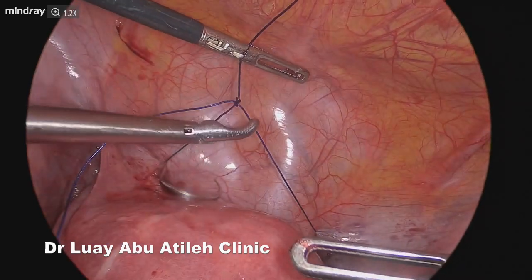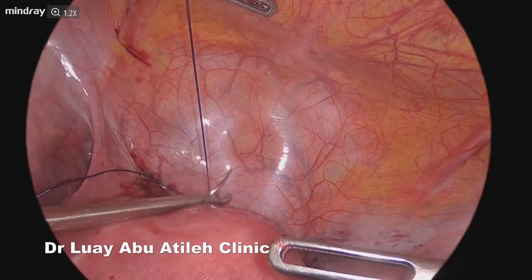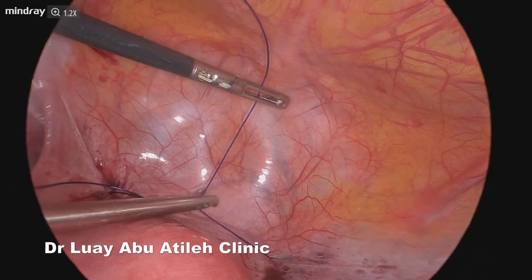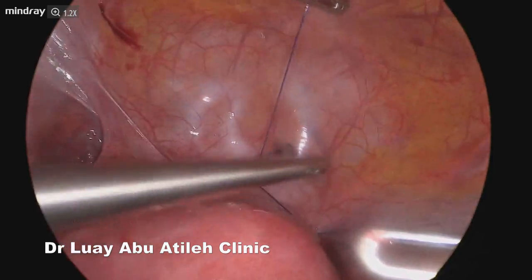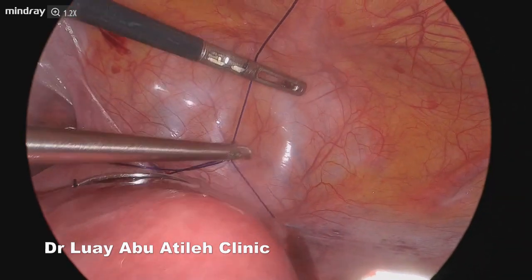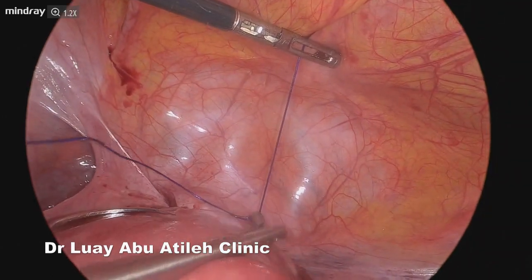As you see in this step, left hand upward and right hand downward — the knot is inverted. Now all you need is to slide it. After you slide the knot, you tighten it as much as possible. We use PDS type 1, which is strong and not sharp enough to cause dissection or transection in the tissues.